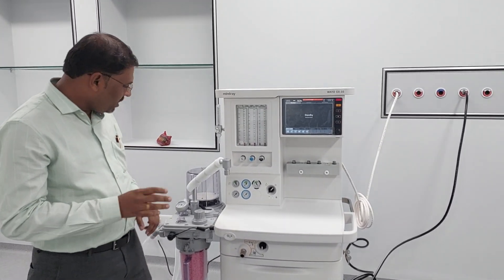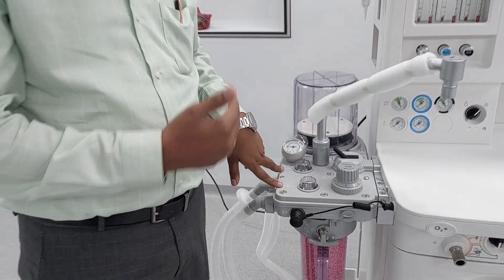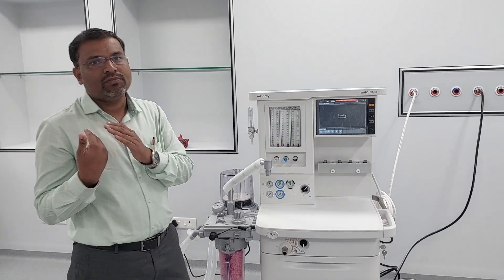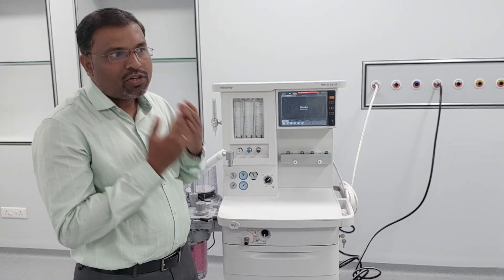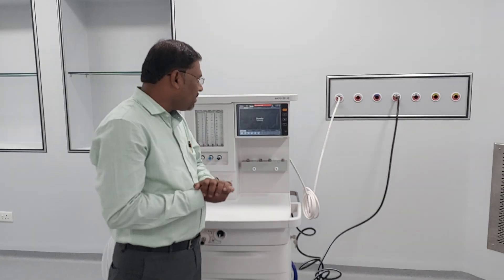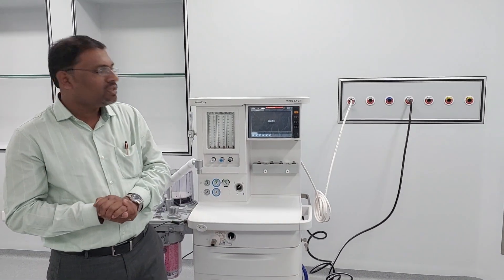In this machine, they have provided two types of flow sensors — one is inspiratory and one is expiratory. One measures the flow going towards the machine, and one measures flow coming from the patient. Whatever tidal volume you set and whatever tidal volume is expired by the patient, it has to be displayed on the monitor and measured with the flow sensor.